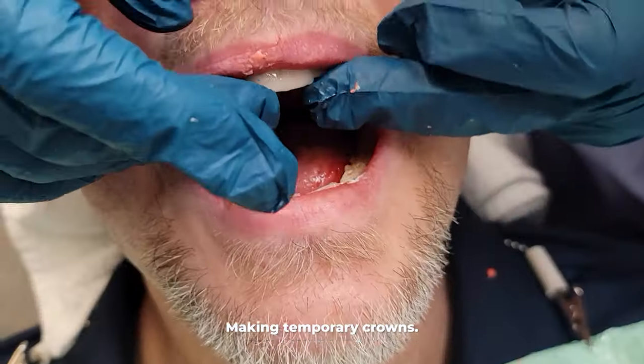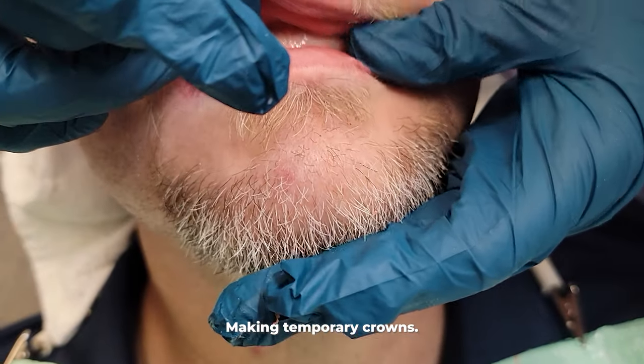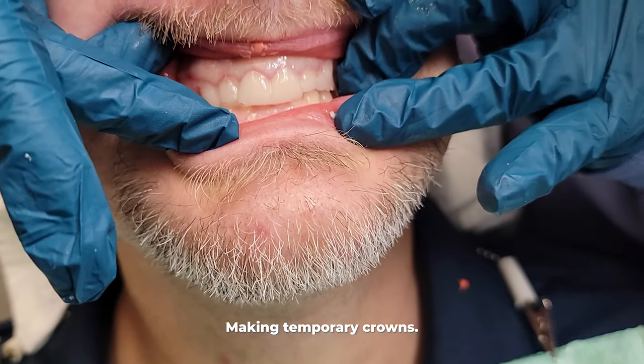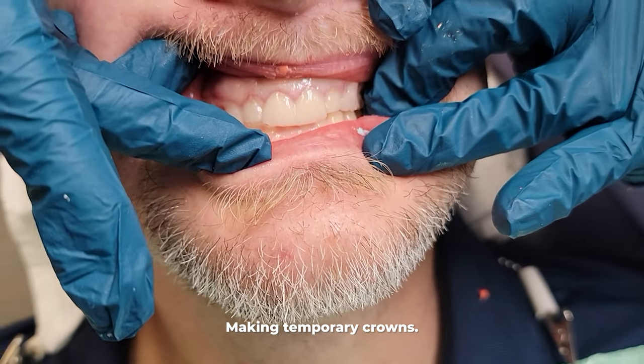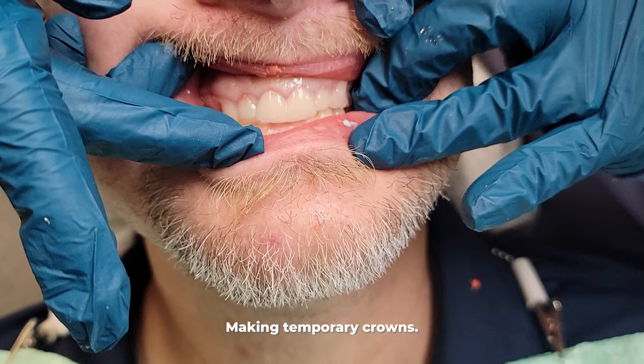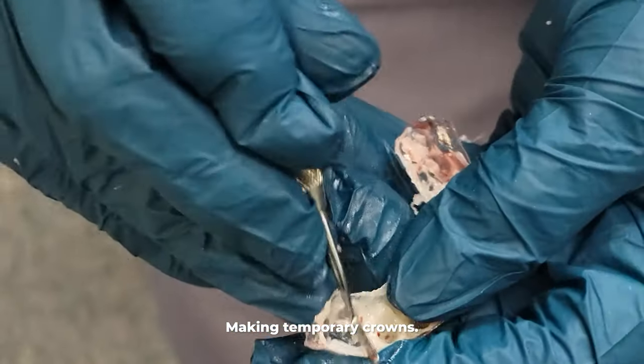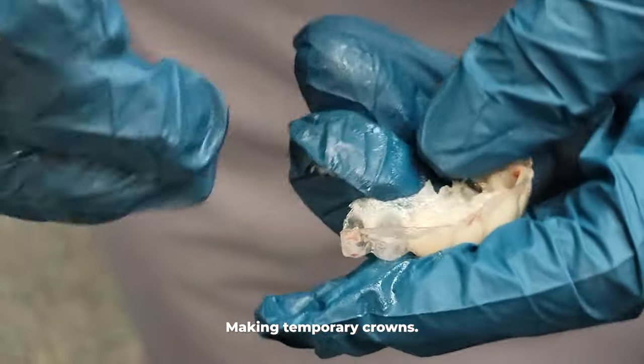The temporary crowns won't be cosmetic until we get the final crowns back. We do this by filling that plastic template with a material that will fill the negative space between the plastic template and the prepped stump of a tooth, and eventually that material will harden in the template while over the patient's filed-down teeth.